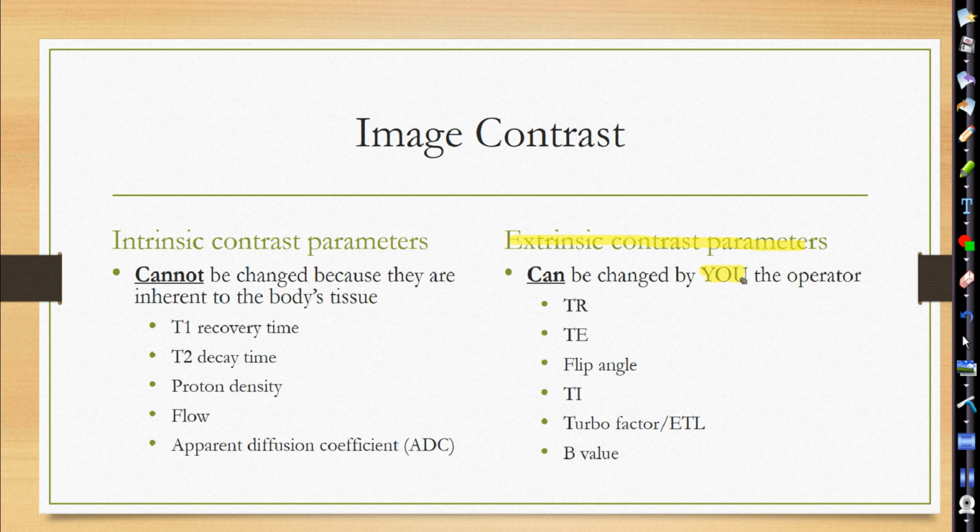So you have your TR. So let's type out what these things mean. I don't know why they flipped the letters, but TR stands for repetition time. Does anybody know what TE stands for? Any guesses? Something echo. Good. And then what does the T stand for, you think? Time. Exactly. Echo time.